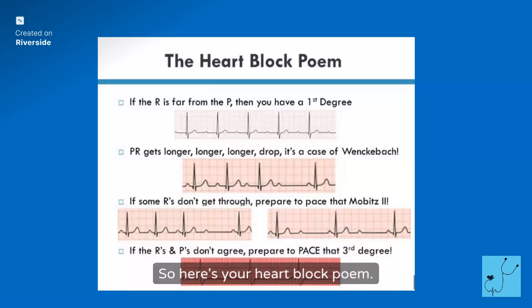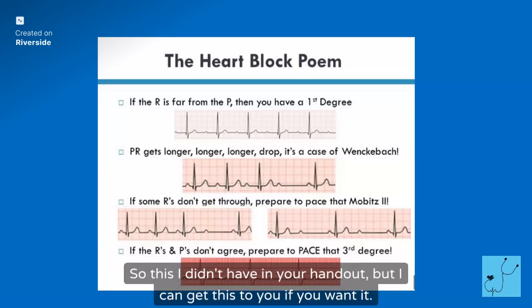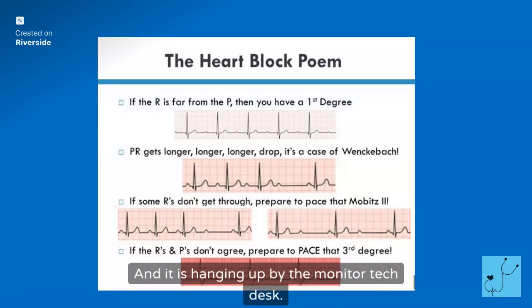So here's your heart block poem. This I didn't have in your handout, but I can get this to you if you want it. And it is hanging up by the monitor tech desk. So if the R is far from P, then you have a first degree. All of these PRs are prolonged.